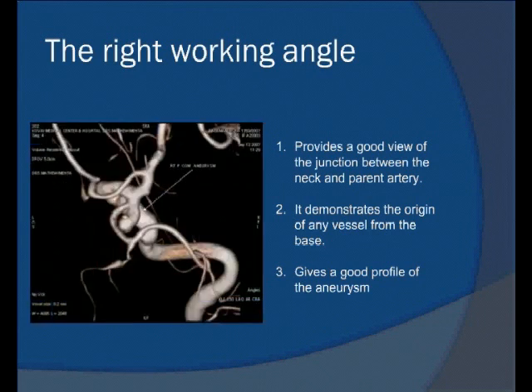So here is the same picture telling you the right working angle. It shows us the profile of the aneurysm. It shows us the relationship between the aneurysm and the parent artery. It shows us also the takeoff of any vessel, if it is there, from the base of the aneurysm.